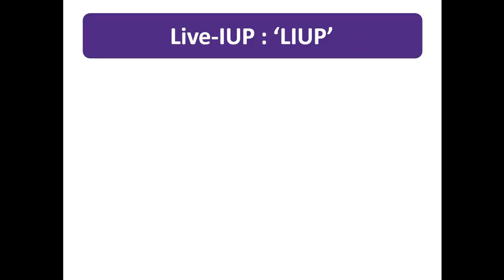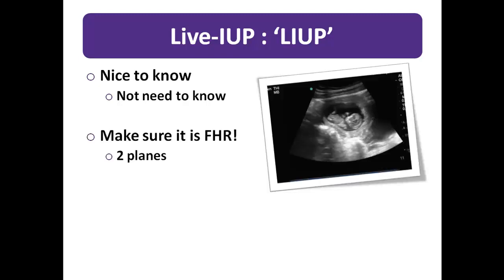Let's turn our attention to another term, LIUP, or live intrauterine pregnancy. This further classification of the pregnancy really falls into the category of nice to know, but not need to know. As long as you've declared an IUP, you are being safe. As always, there are a few issues that you must be aware of. One may make such a call of LIUP as long as the cardiac activity is being observed within the fetal pole and is clearly distinct from the wall of the gestational sac. Recall that maternal pulsations will also be present, so the two should not be confused. Be sure that you scan in two planes to increase your confidence in this assessment.